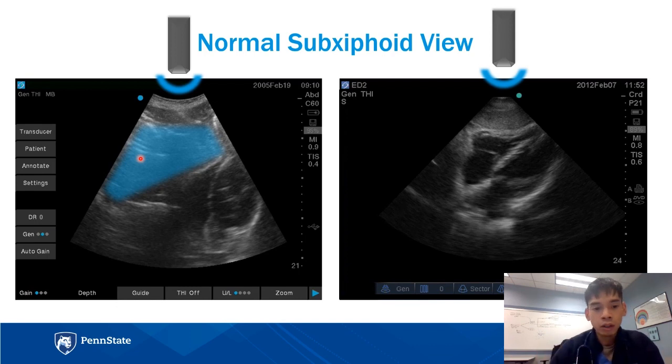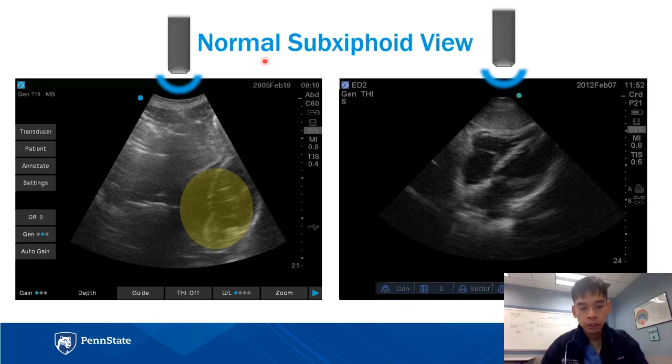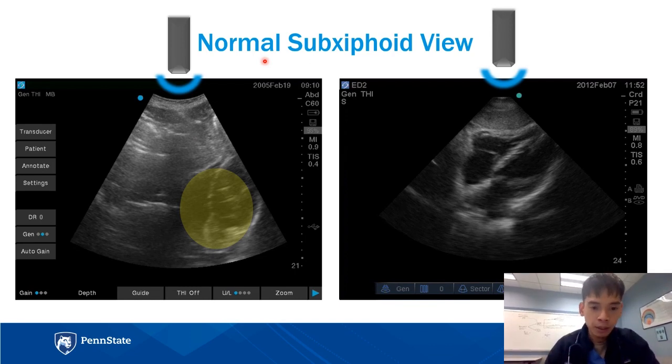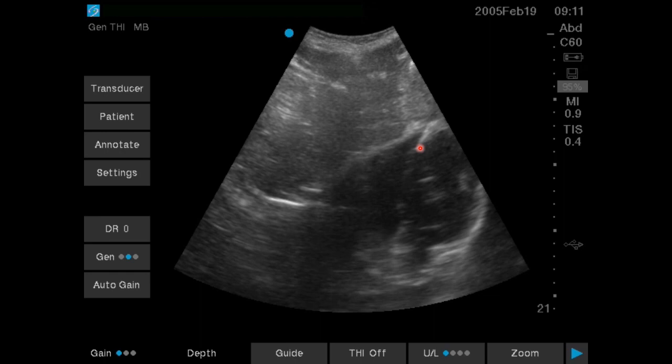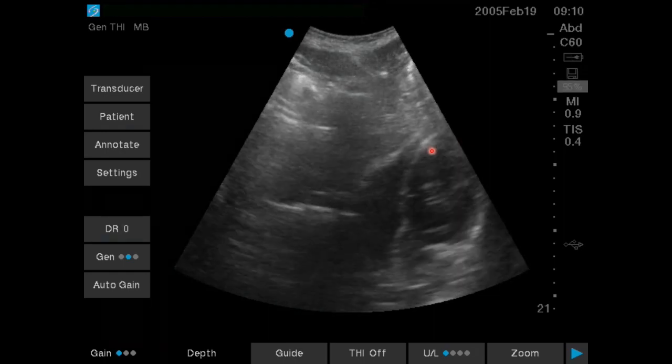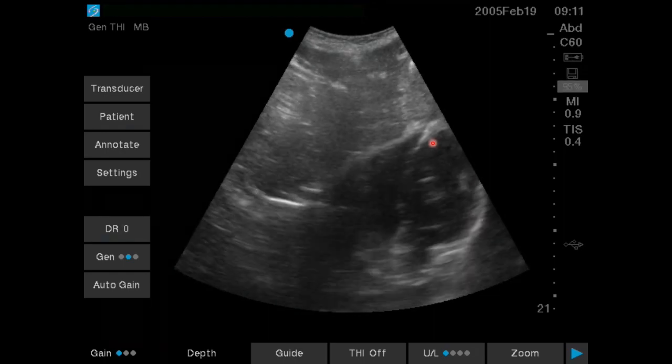Okay. If you look back at the slide, you'll see the liver is a little bit more inferior. Therefore, you'll hit it with the ultrasound at the subxiphoid view first. Okay. And then finally, we'll get the heart. Again, as we do more of these, we'll identify these structures more easily as we do it in person. These are standstill pictures, and once you see the live picture, you can see the heart here, okay? The only organ that's beating, okay?